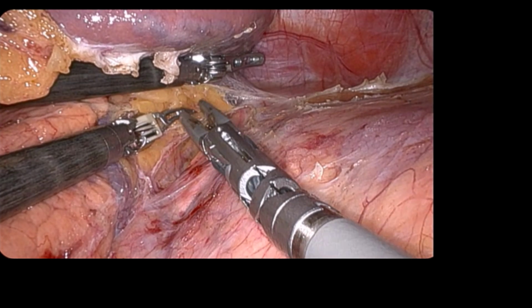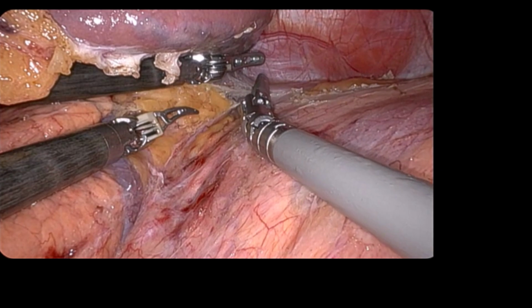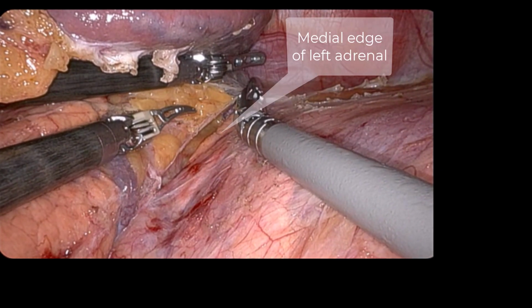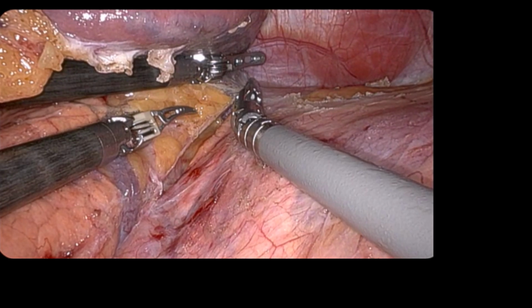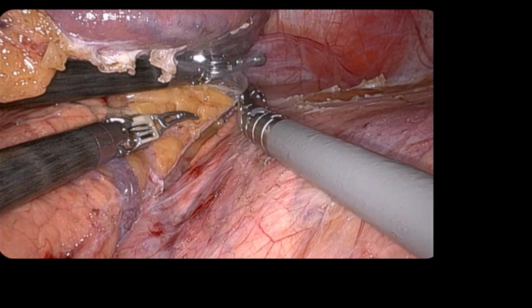Lastly, when we're doing robotic cases, I tend to use a tip-up instrument to retract the liver and spleen. I much prefer the paddle retractor because of the ability to get more purchase against the liver, spleen, and pancreas, which helps provide more space during the medial dissection. I also notice less sliding and need to replace the instrument, and I have more ability to customize the area across which I'm retracting.